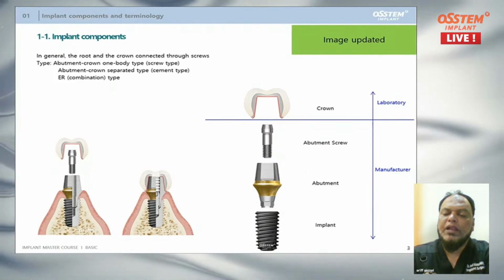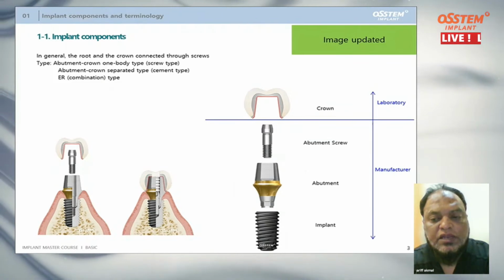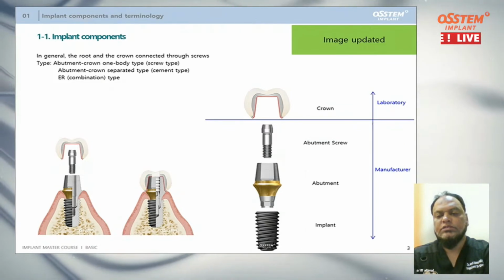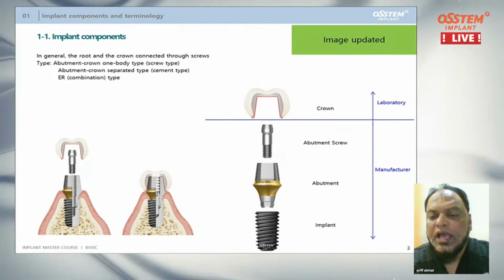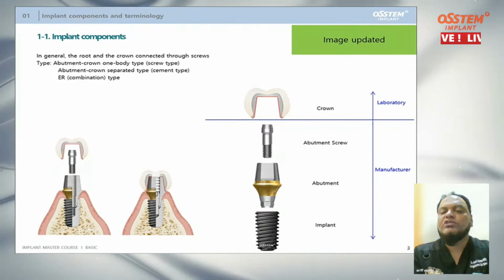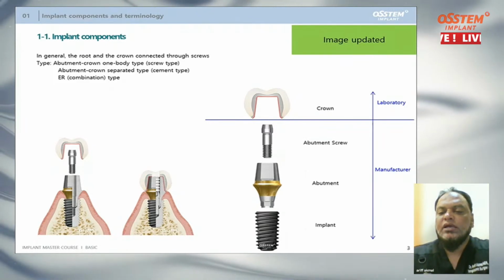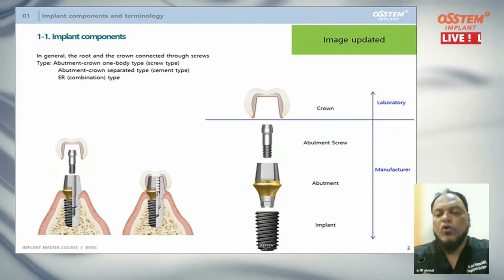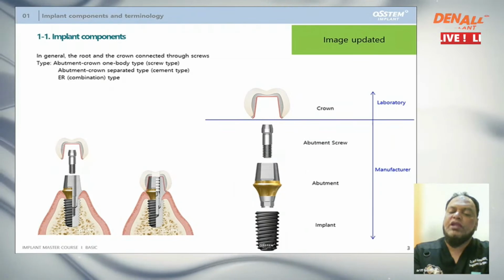So just having one implant on the table and starting the case is not at all advisable in implant dentistry. From that day onwards, I made sure that I'll have at least 4 or 5 implants. So if I plan for a 4 into 10 implant, I make sure that I have 4.5 into 10 as well and 3.5 into 10 as well.